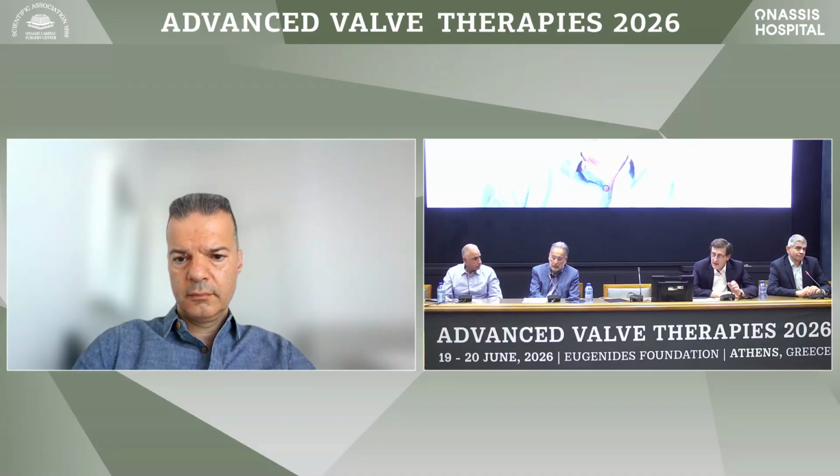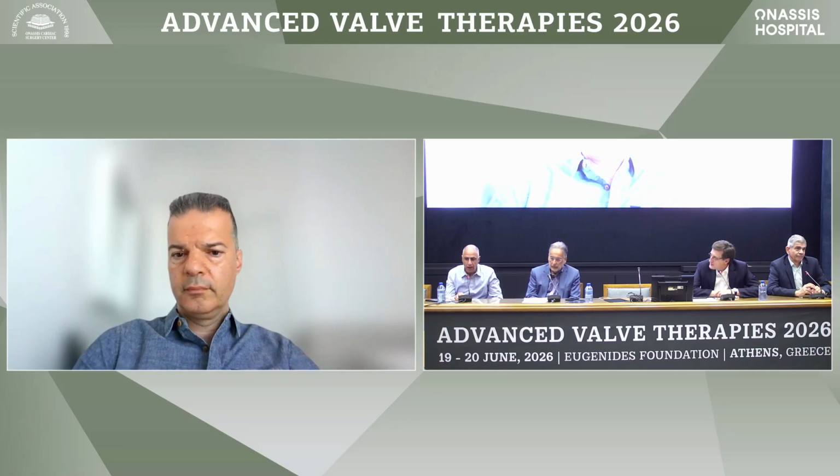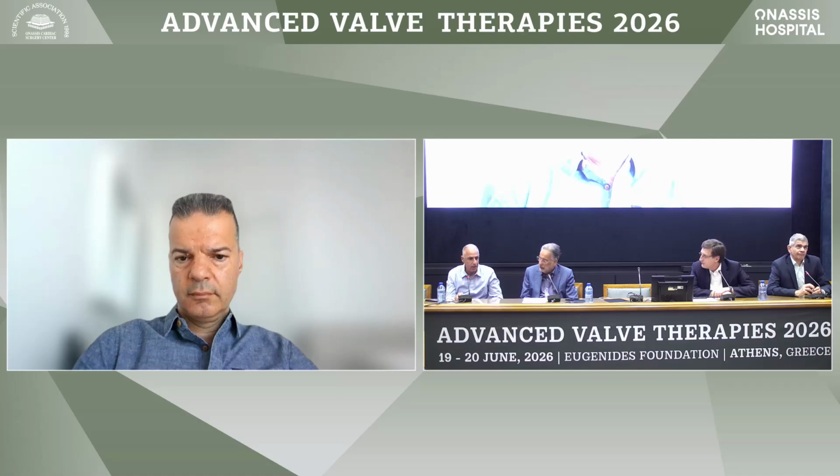Yeah, excellent case, and exactly what you were saying, Dr. Shuvy. They are one anteroseptal and one posteroseptal, and interesting. Do you also see all the time this independent movement, or it happens? Great case. I always do as Vlasis does. I always do independent grasping. I always get the lateral first and then slide slowly to the septal and grasp it. Always start in the anteroseptal and then add the posteroseptal because of the imaging issues. The posteroseptal is more challenging. You're going to the posterior part. There's more cords there. The imaging is more challenging, and therefore you should be very careful when you are there.